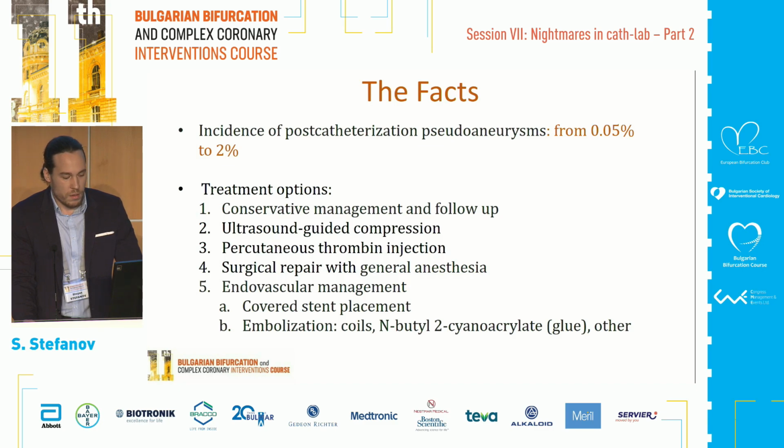One is that the covered stent actually covers all the side branches, not just the pseudoaneurysm. But the main risk with this strategy is the risk of stent occlusion, especially in this part of the body where repetitive hip flexion during the motion of walking puts stress in the inguinal area and thus mechanical stress on the covered stent.